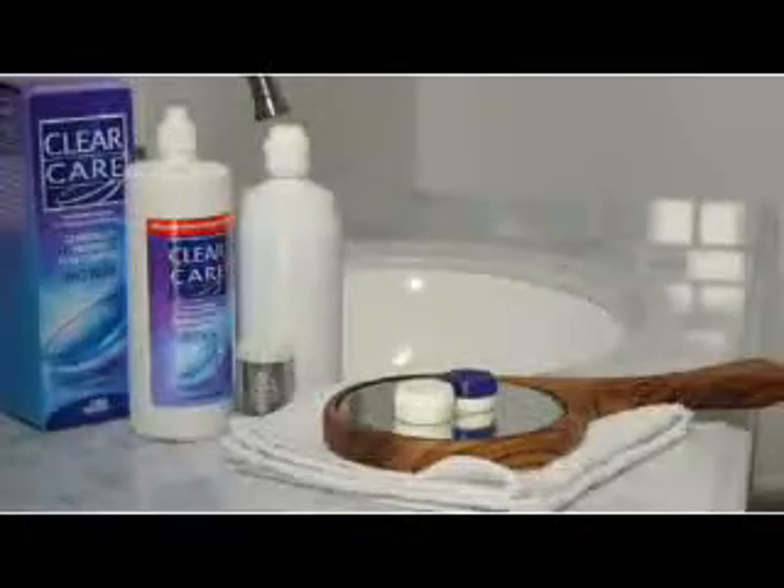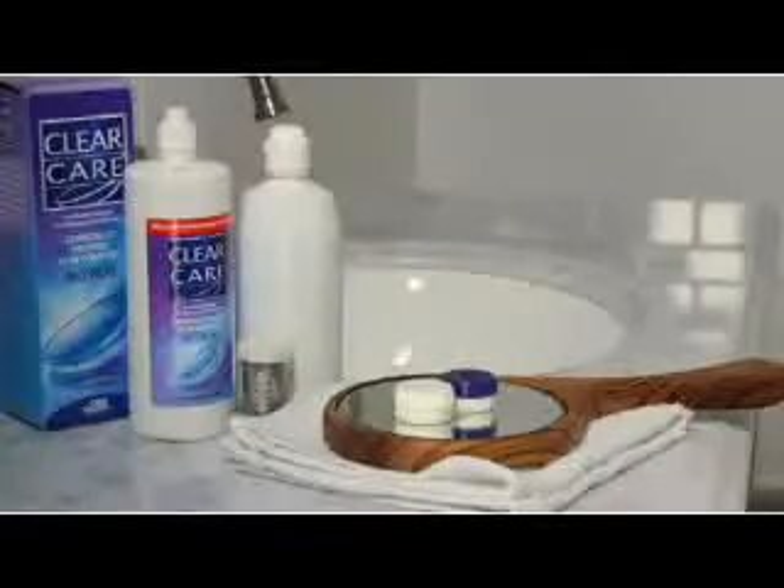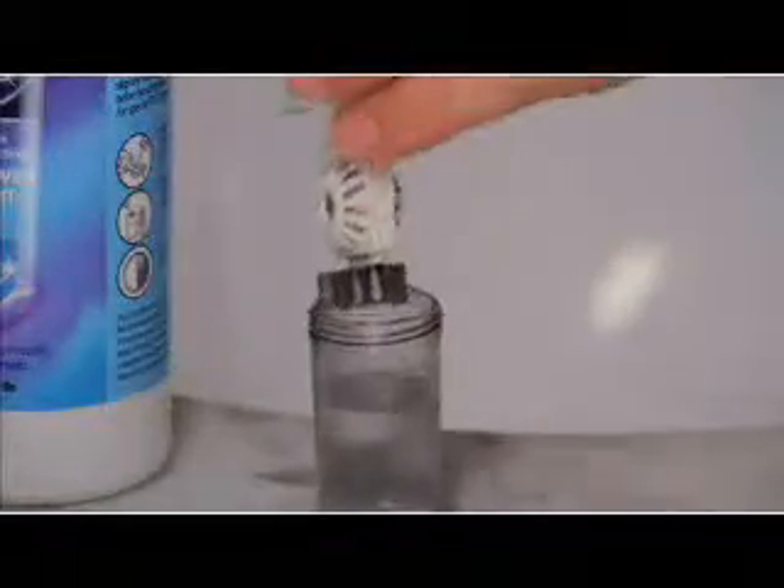As you begin wearing your new hybrid lenses, you should expect a brief period of adaptation. Inserting, removing and caring for hybrid lenses requires special care different from soft or hard lenses.